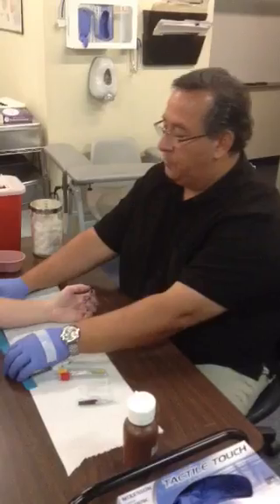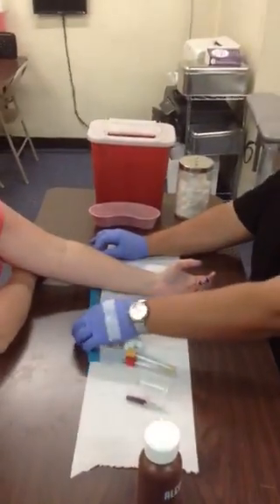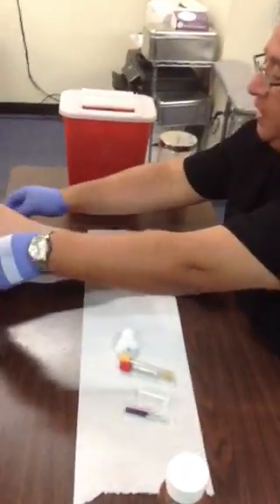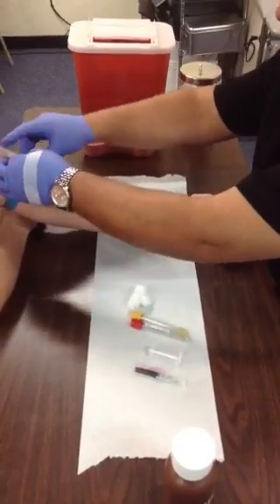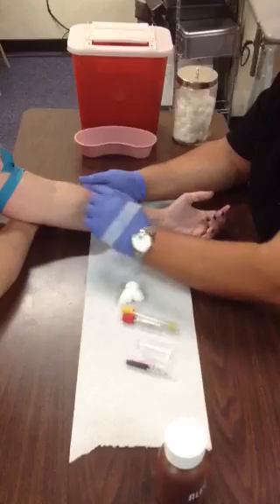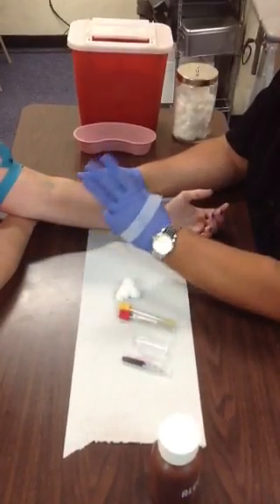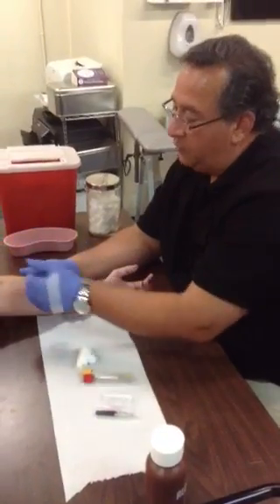The first thing you're going to do is identify your patient, check for allergies, and then find a vein. Place the tourniquet about three to four inches above the puncture site. We're going to be sticking somewhere in the bend of the arm — it's called the AC. Find the vein and establish three things: the center of the vessel, the direction that it goes, and how deep you think it is.